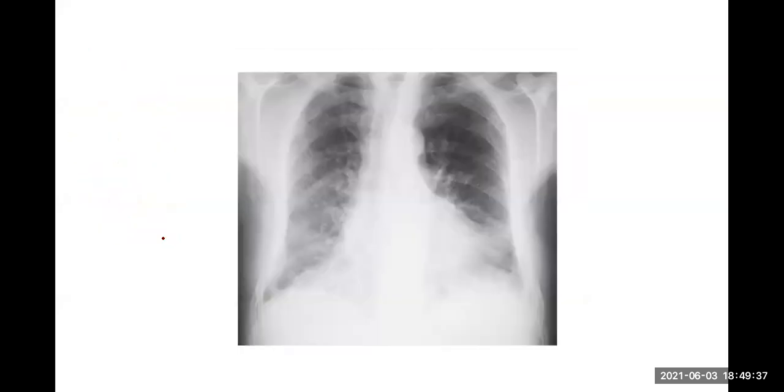So again, similar sort of things. The only clue sometimes to differentiate this might be other sort of subtle things like here. මේ බලන්න මේ මොකද්ද මෙතන තියෙන්නේ? ඔය හතරක් පහක් මං කිව්වනේ ඒවා හරි අමාරුයි වෙන් කරගන්න. But මේ වගේ දැක් තිබ්බොත් ලේසි. මොකද්ද මෙතන අපිට පේන්නේ? What can you see here? Cardiomegaly. So that is an indirect clue saying that මේ සුදු patches everywhere are heart failure. Sorry, සුදු patches everywhere are due to pulmonary edema.